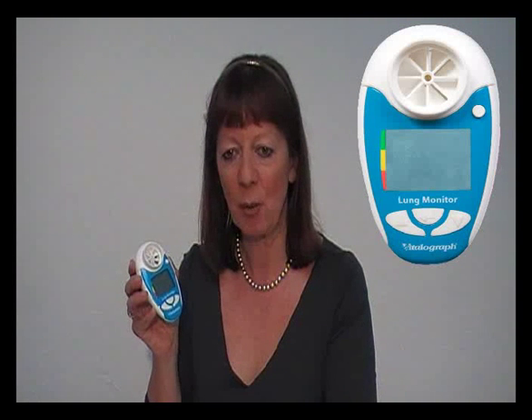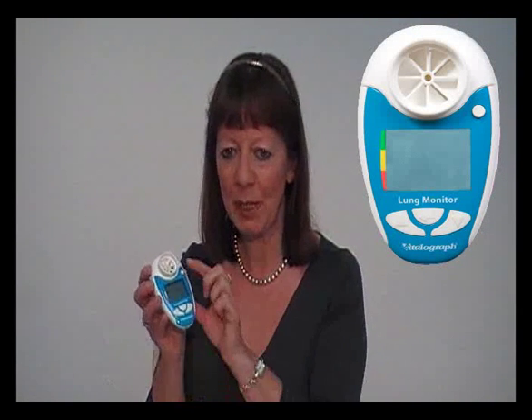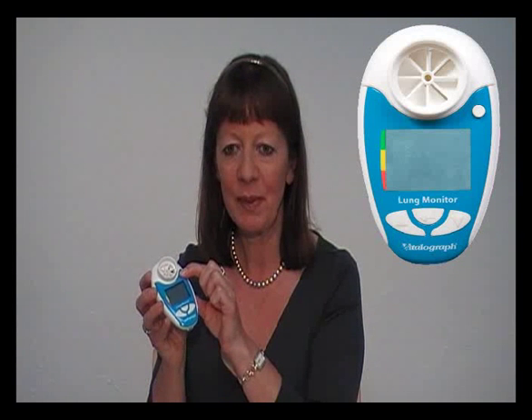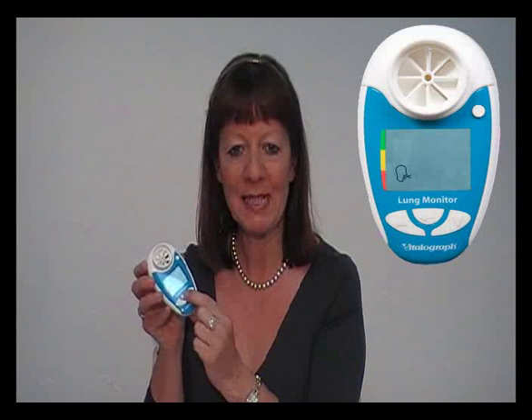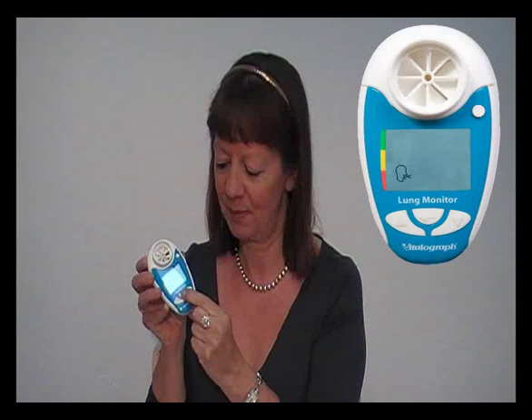Once you have a number of sessions stored in the Lung Monitor, you may wish to review the history. In order to do this, simply switch on the device and hold the enter button for 3 seconds. You can then use the up and down arrows to scroll through previous test data.